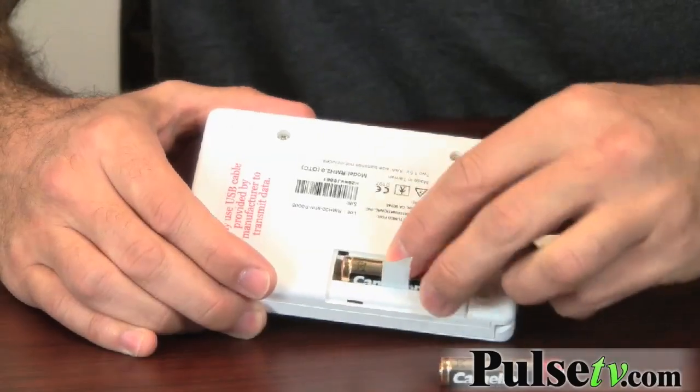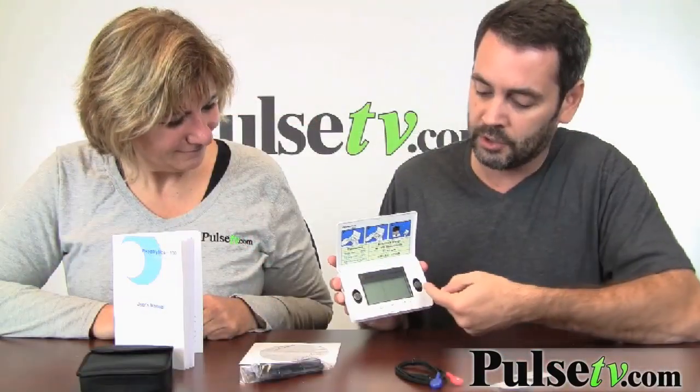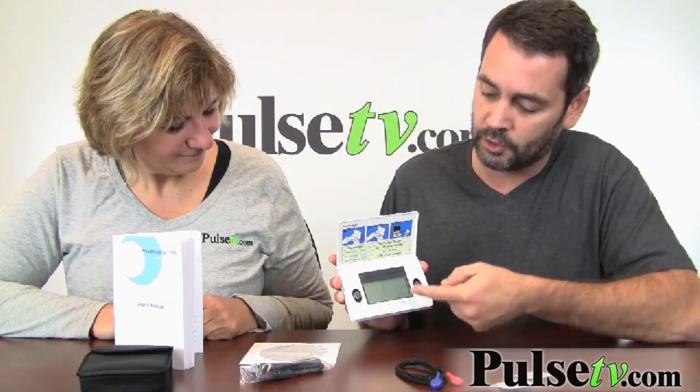It takes two AAA batteries, which are easily installed in the back of the device just like this. What you do is place your thumbs on these two pads here, which measures your heart rate.